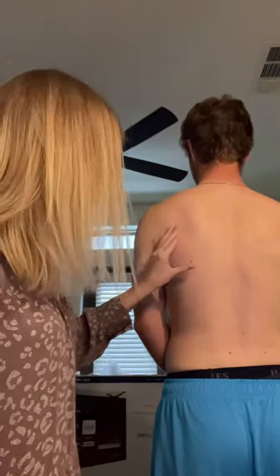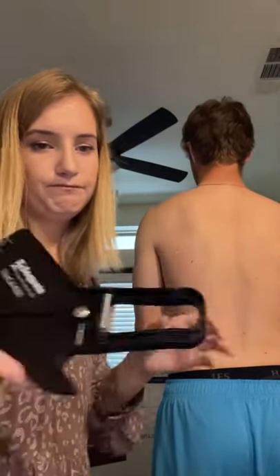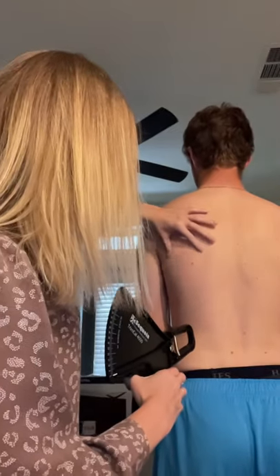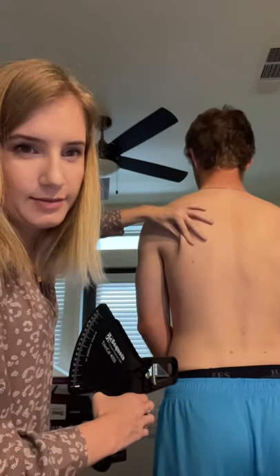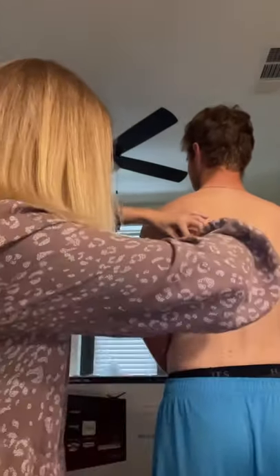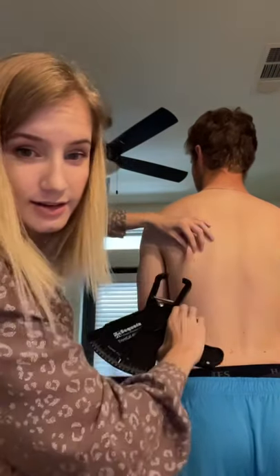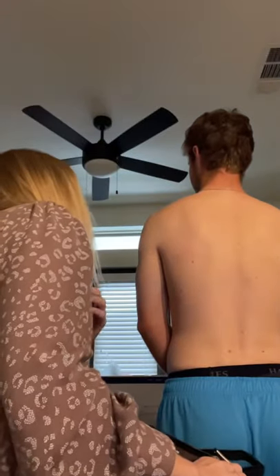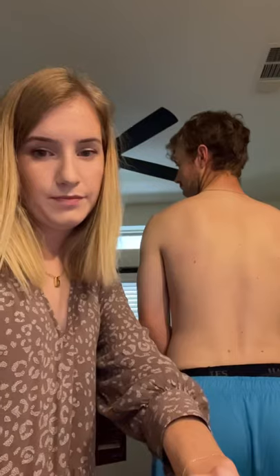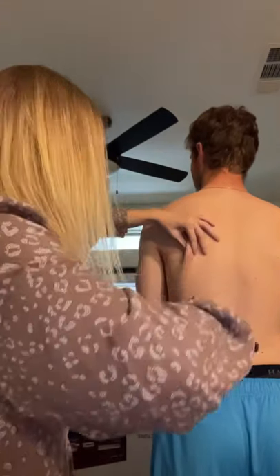Now we're doing the subscapular skinfold, which is basically the lower part of his shoulder blade. Readings are 10, 12, and 11.